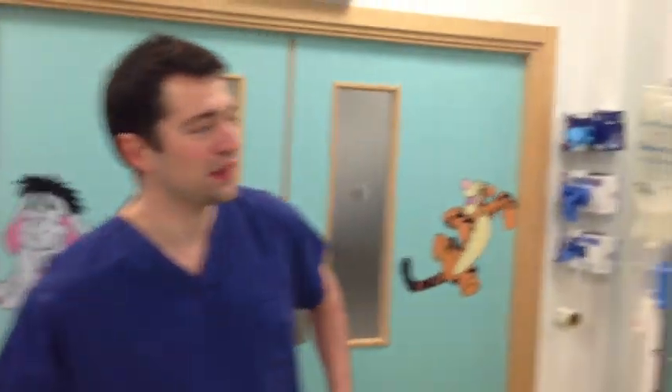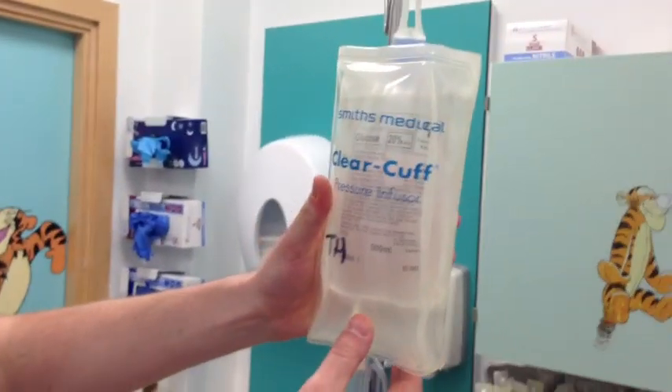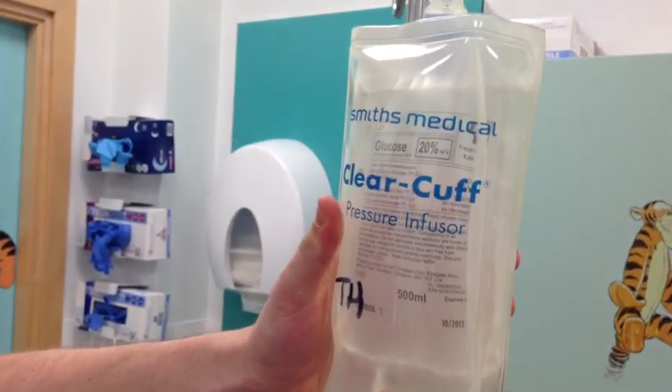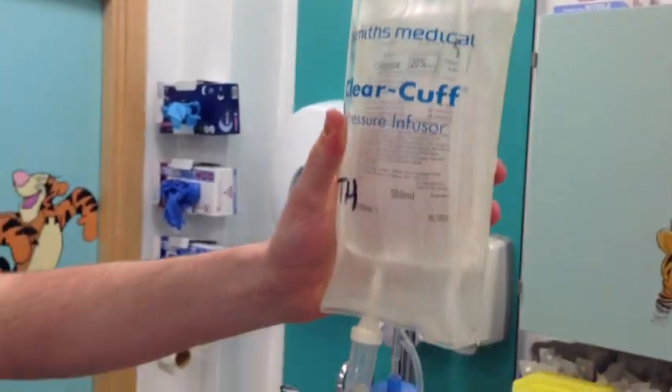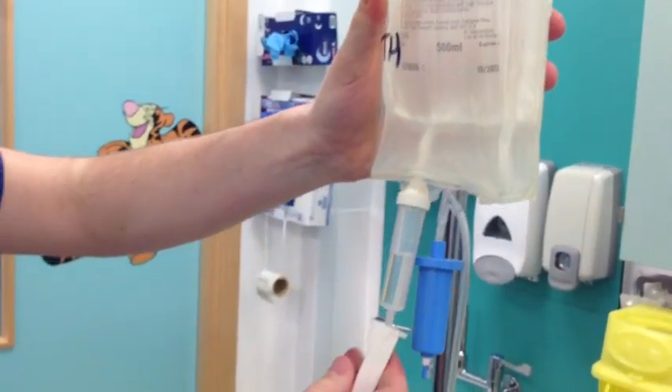So that was a correctly set up arterial line. This is more of an arterial line you would expect to get in your exam. Could you please examine this arterial line? So from the bag end down to the patient end, this clearly is a 20% glucose bag, which is incorrect for this setup. The bag itself is not pressurised, which would give inaccurate readings.